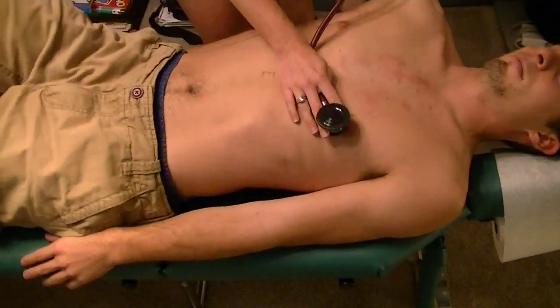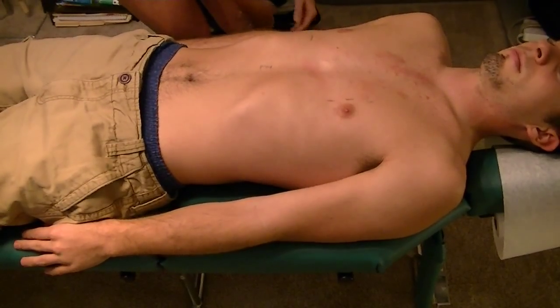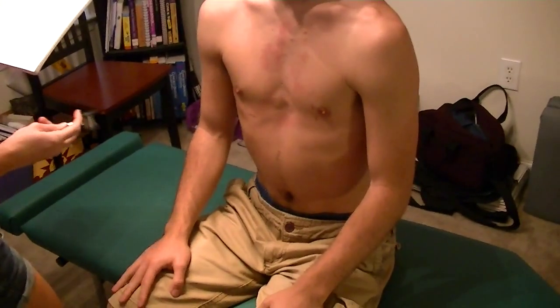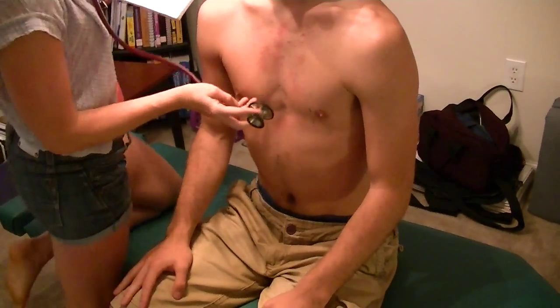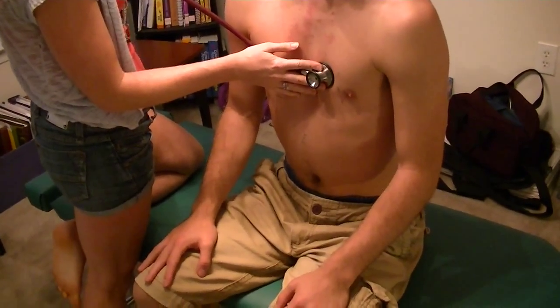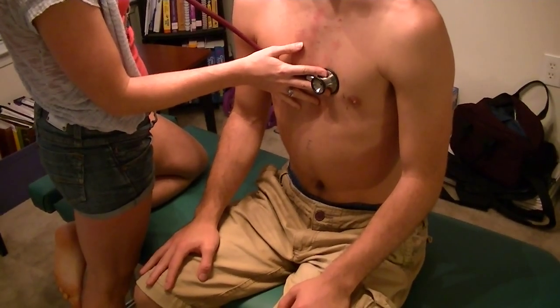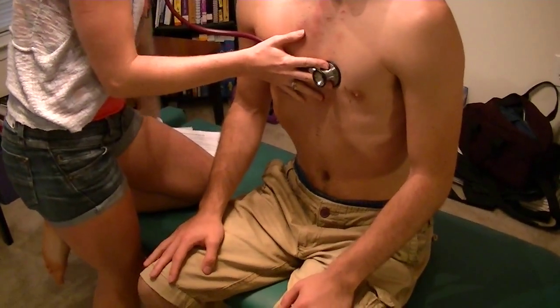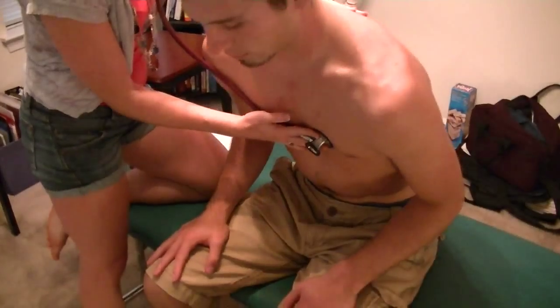Thank you very much. And then you have the patient assume a seated position. So you got to sit up and have a seated position. And then you place the diaphragm at the aortic area or at Erb's point. So wherever you prefer, making sure you have the diaphragm placed here at the aortic or Erb's point. I'm going to go ahead and place mine at the Erb's point. And you have the patient breathe in and let out with a slow sigh as they lean forward. So as you're leaning forward, slow sigh, release it.